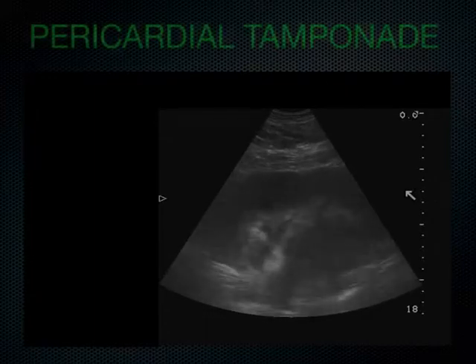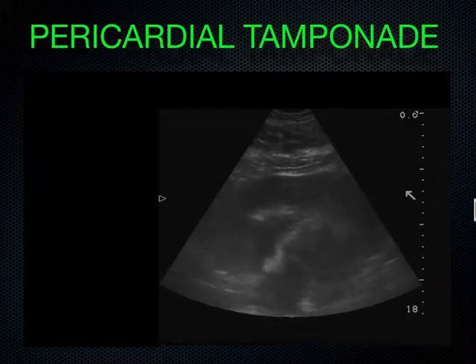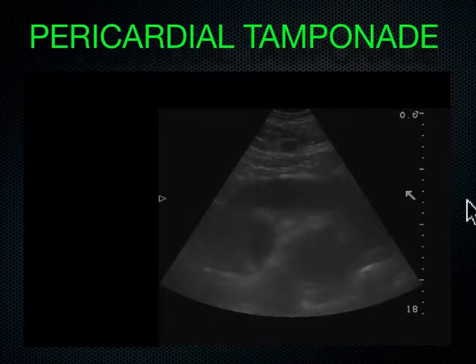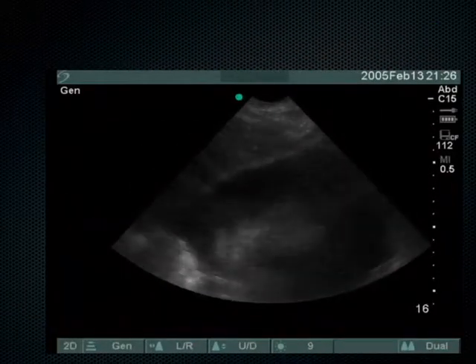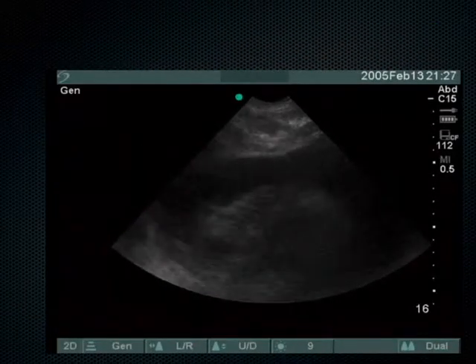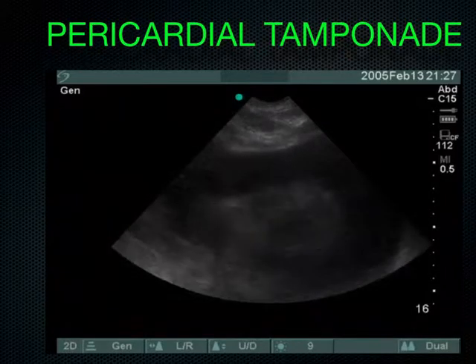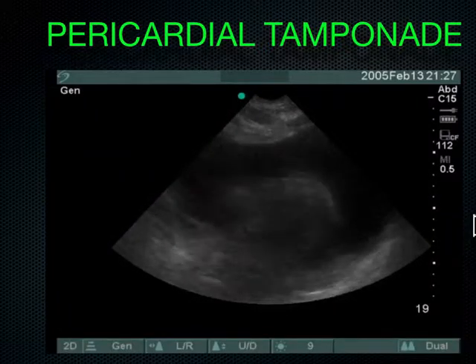This is an example here of the tamponade. Notice again, it's this jumping up and down trampoline effect that's easy to see on the screen to say that there's diastolic collapse. It's just another example here of a pericardial effusion that the heart is swinging around in that pericardium. That's also kind of hard to tell whether there's jumping up and down here or not.